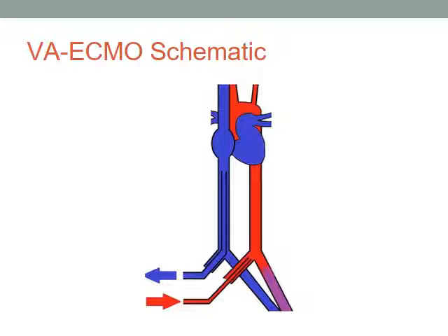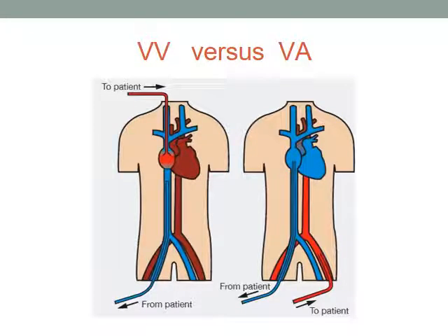If your lungs are damaged, then you've got hypoxic blood coming out of the heart that's in competition with blood coming out of the ECMO circuit, and somewhere there'll be a break point. Before that break point, on either side of it, one side's going to be blue and one side will be red. Okay? Sort of makes sense? We'll talk more about that. I'm not going to talk about this slide. That'll just be in your packet for later look.